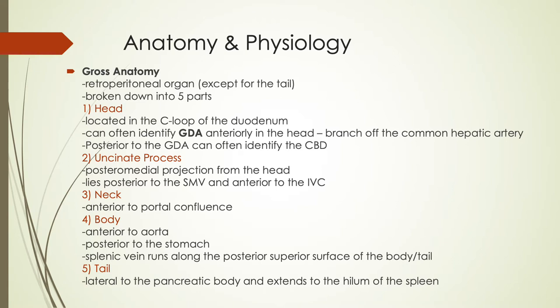The uncinate process is a posterior and medial projection from the head, and it lies posterior to the superior mesenteric vein and anterior to the IVC. The neck of the pancreas is seen anterior to the portal confluence, which is where the splenic vein and the superior mesenteric vein join together to form the main portal vein. The body of the pancreas is seen anterior to the aorta and posterior to the stomach, and the tail is lateral to the pancreatic body and extends to the hilum of the spleen.